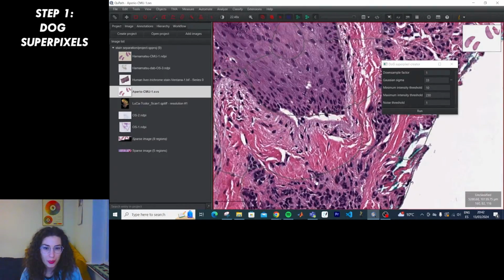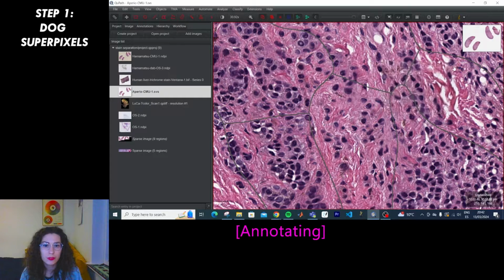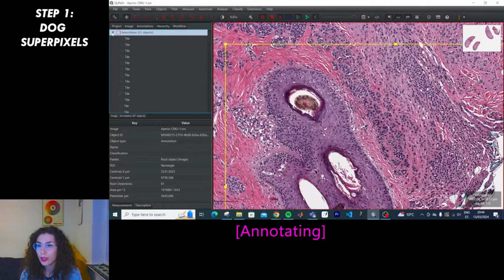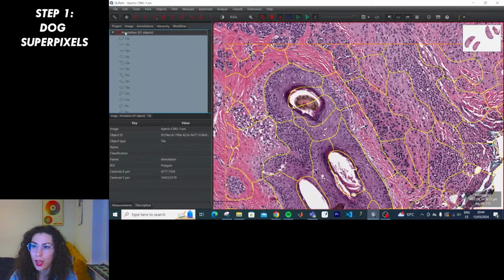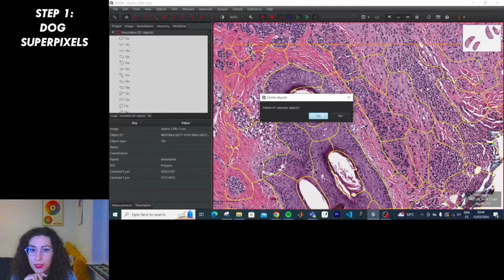Yeah, I guess this is proving why they're not recommended for most tasks. Okay, if I close it, what happens? I've got 81 objects. In the hierarchy, can I do Control A, and then unselect this one. Objects, delete selected objects. Yes.